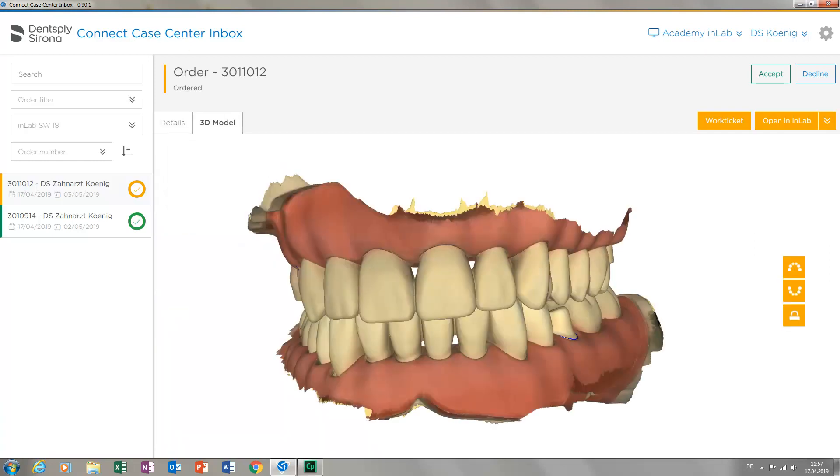The 3D models of both the upper and lower jaw can now be rotated in all directions with the left mouse button. You can zoom in and out with the mouse wheel. Before we proceed with further functions in this view, let us look at our model from different angles.